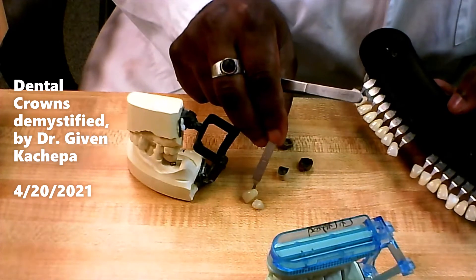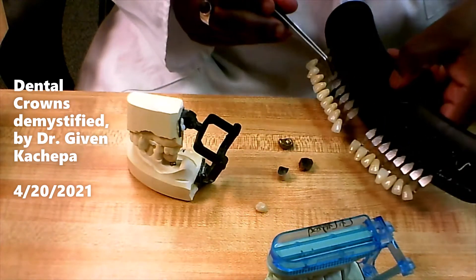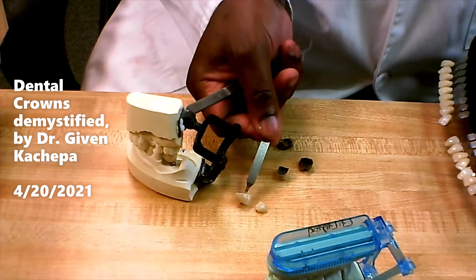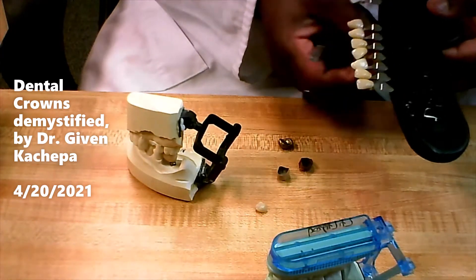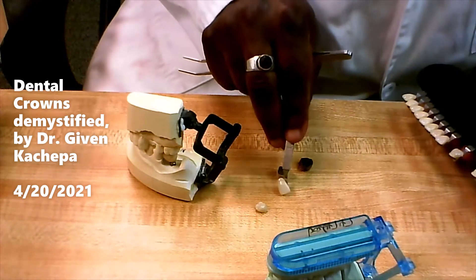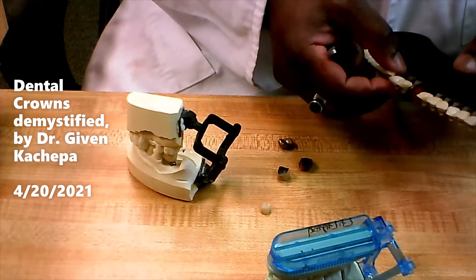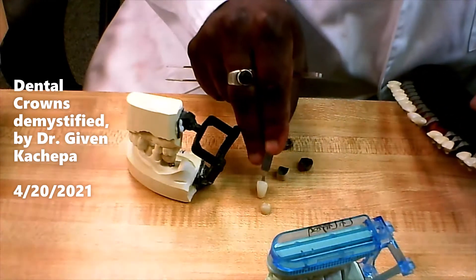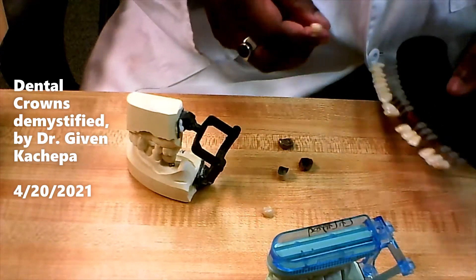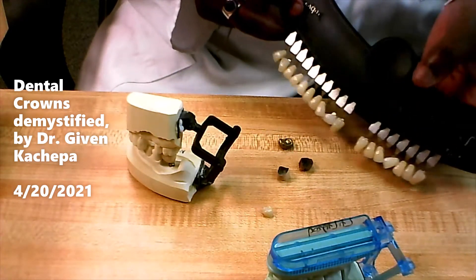You go through the row to find the best match. These two are pretty close, but not as close as I'd want. If I try this one here, it's a little too dark. If I come to something a little bit lighter — maybe a little bit too light — then just another shade darker until you get something very, very similar. You have to go through the row to make sure you found one that matches the patient's color. There are many different types of shade guides depending on what material you're using.